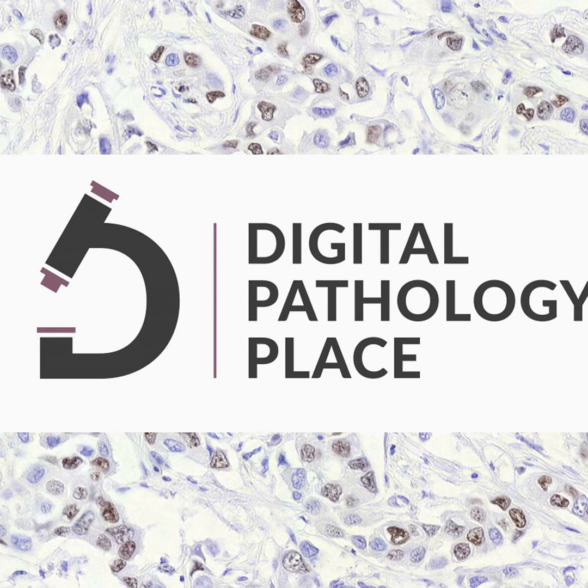But currently scanners initially store the images in vendor-specific formats and only provide DICOM converters, with only a few producing DICOM directly. And this conversion is not lossless. What does that mean? That it loses something, some information.